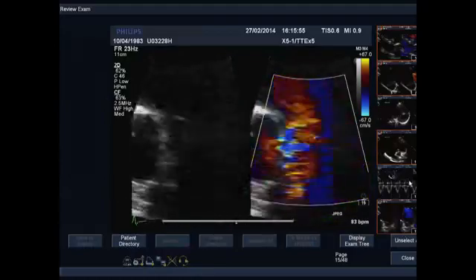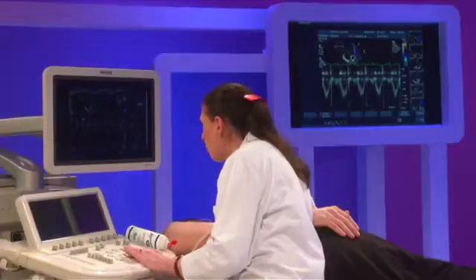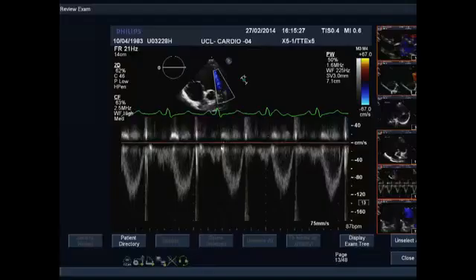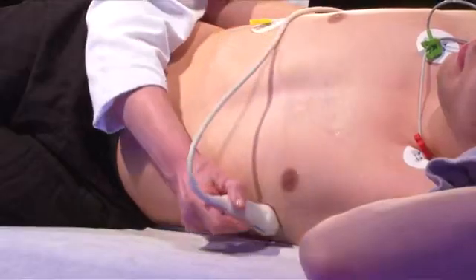After, in the same position, I will put my pulse wave Doppler inside the right ventricular outflow tract and make some measurements. So I will take here with my cursor the VTI. I will also make the measurement of the distance between two QRS complexes to have the heart rate, and after that I will move back to the apical four-chamber view.